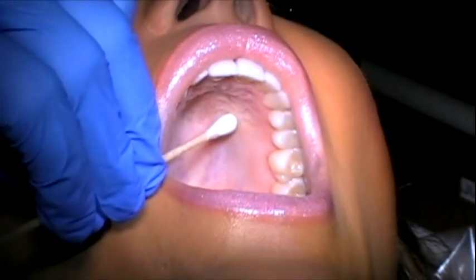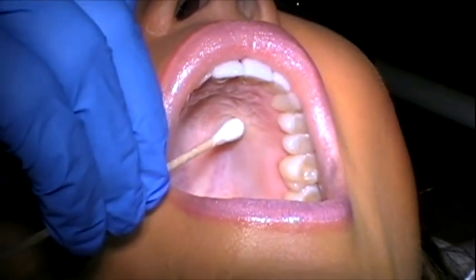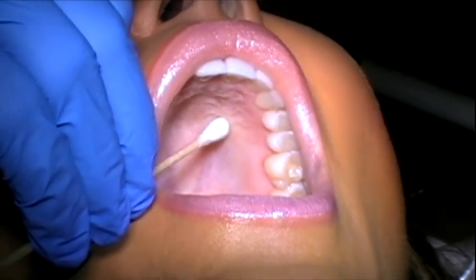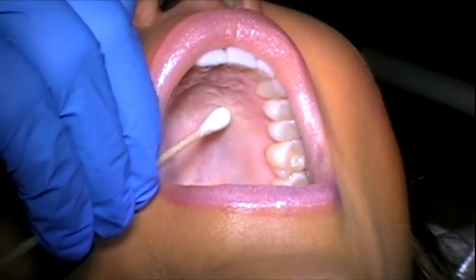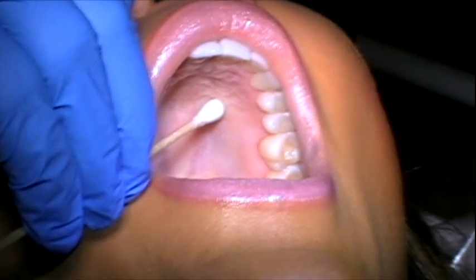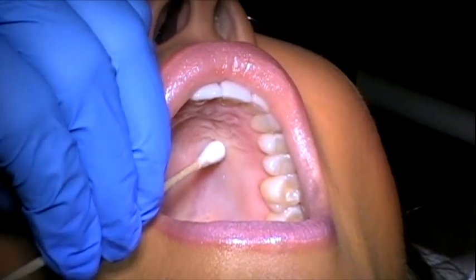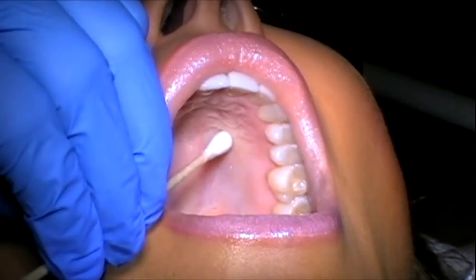You're going to use pressure anesthesia. I've applied the topical onto the same q-tip and I'm just going to be pushing very firmly for at least a minute — two minutes is better. This injection is going to get the premolars and the anterior teeth, the incisors and the canine on the side of injection. They're going to become anesthetized pulpally, and it's also going to get the palate from the molars to the central, so it gets the entire side of the palate on the tissue.